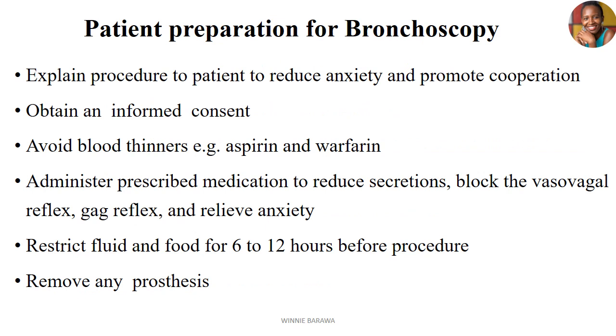So like I say, these are special procedures, and therefore they need keen preparation before the patient goes in for the procedure. So tool number one, when you're preparing a client for bronchoscopy, start by explaining the procedure to the patient. This is to help us reduce anxiety and any lack of cooperation from them. So explain the procedure in detail to the patient, how it's going to happen, what management will be brought in, and how this patient can actively participate as part of this procedure.